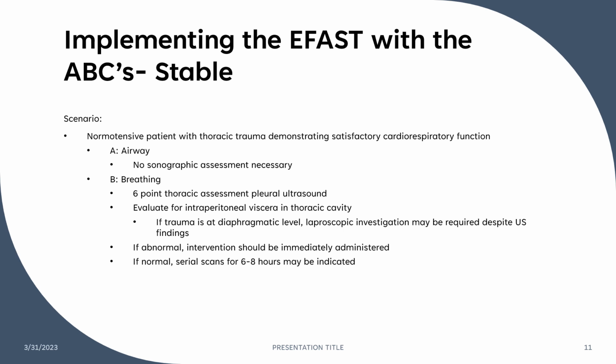if you have a normal scan or an inconclusive scan, it can be prudent to either complete serial Efast exams or serial portable chest x-rays for 6 to 8 hours to make sure that the patient's state does not deteriorate.